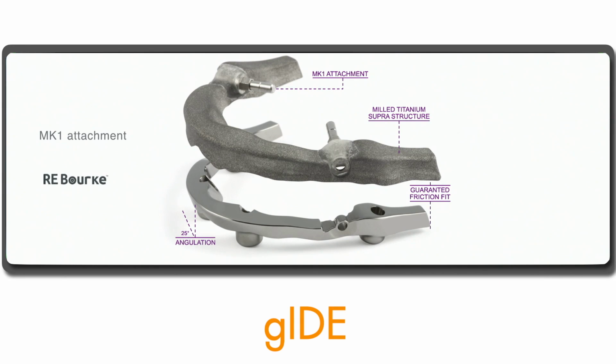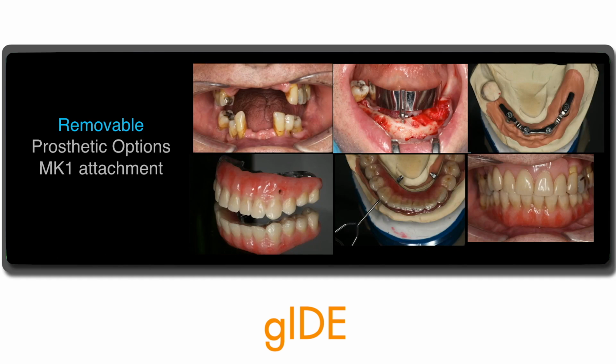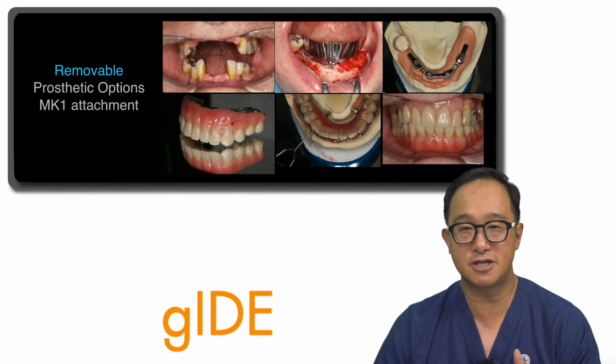And this attachment is a very nice attachment because it's like a friction fit system, and it really feels like a fixed type prosthesis for the patient. So here, if I show you how this works, we carry out the implant treatment, and the difference with this is that the final bar has these little pins. When you need to lock the prosthesis in, you basically press on the lingual of that prosthesis, and the little pins fit into the metal bar in the patient's mouth. So it basically locks the patient in.